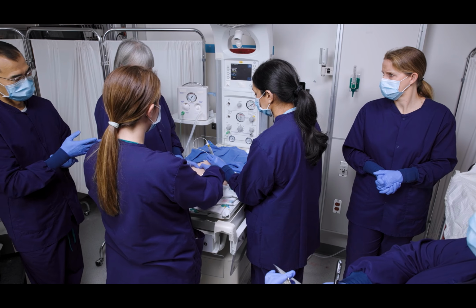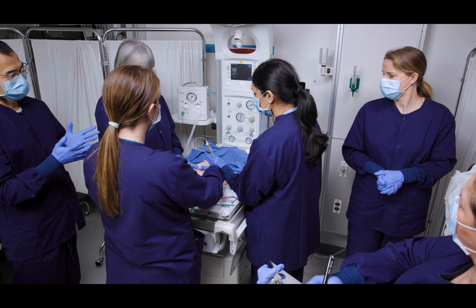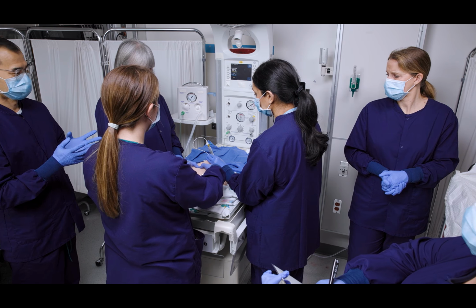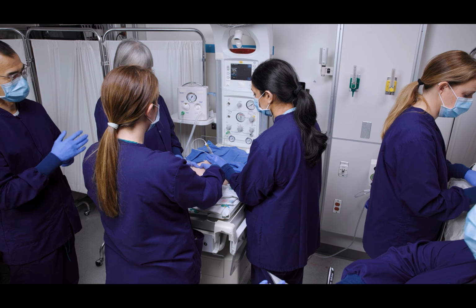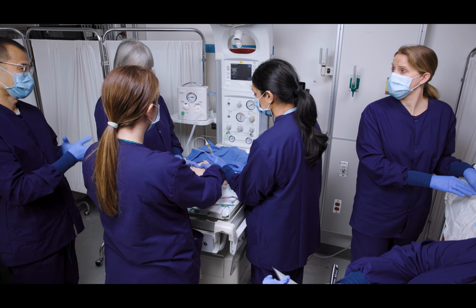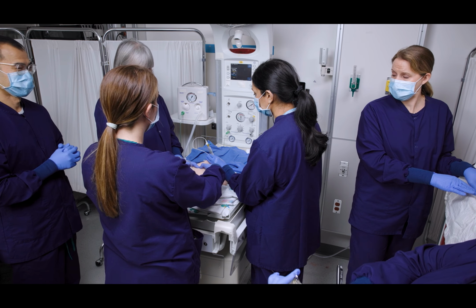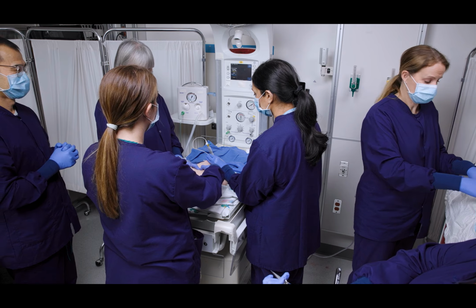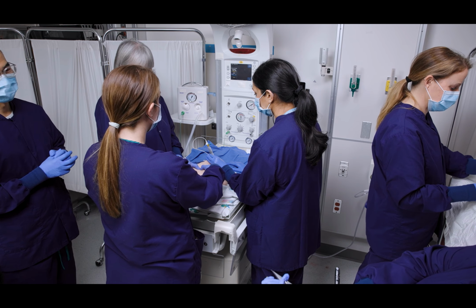Now let's administer a dose of epinephrine for the UVC. The medical provider and medication nurse use closed-loop communication to order and administer the medication. "Chris, this baby is approximately 3 kilograms. Prepare 0.2 mLs per kilo of the 1 milligram per 10 ml epinephrine, which is 0.6 mLs for the UVC."